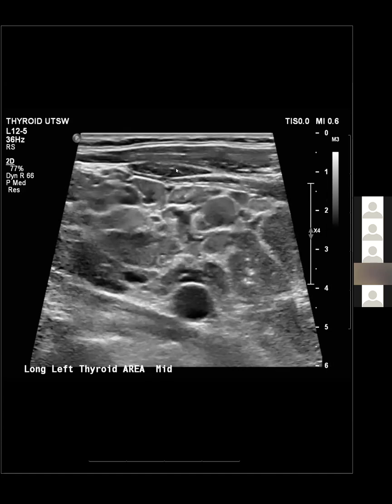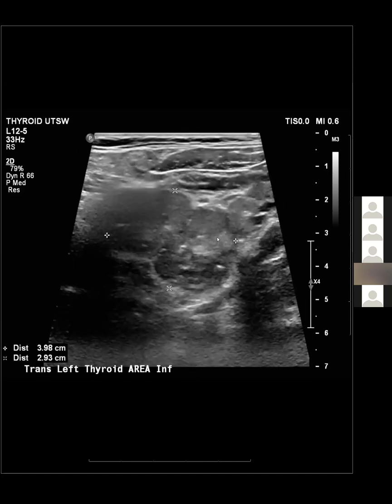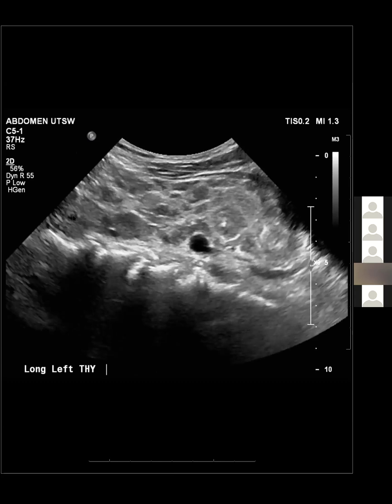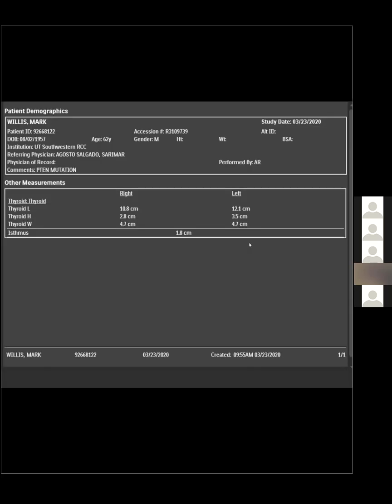This reminds me of that case you showed last week of the thyroid lymphoma. Although, right, there weren't as many bands in that other one. Right. I mean, you can see how big this thyroid is, but this was chronic for this patient. And again, it was a thyroid enlarged and carved up into innumerable nodules, as opposed to the one I showed last week, where there was no defined nodule.